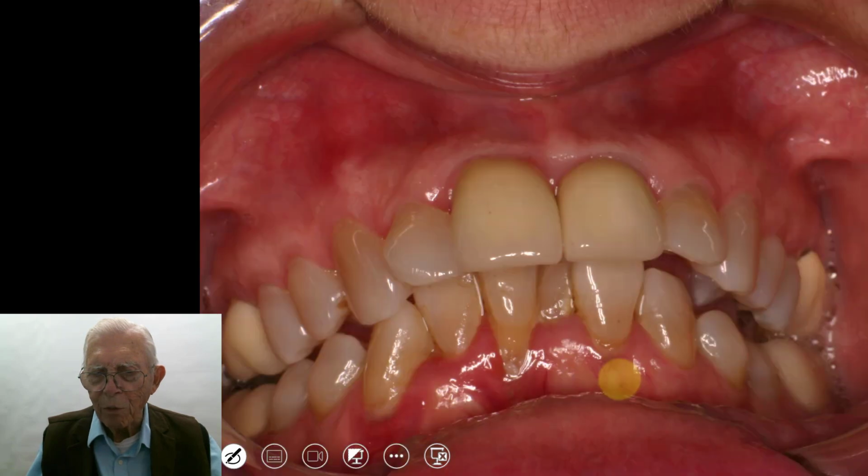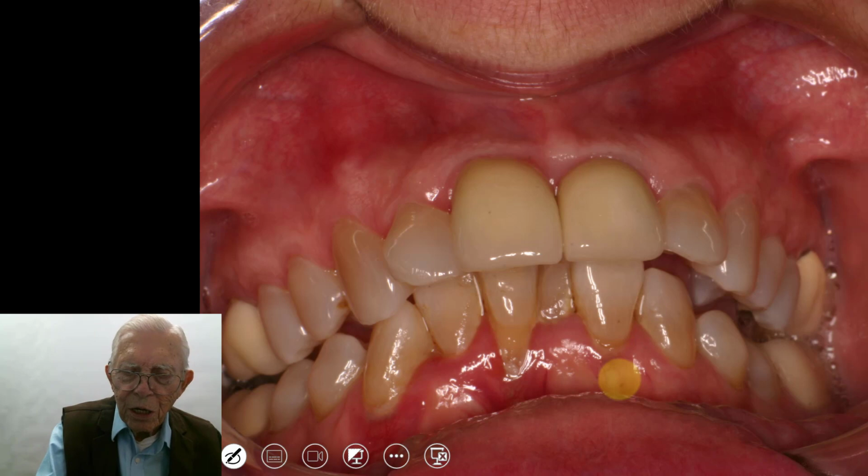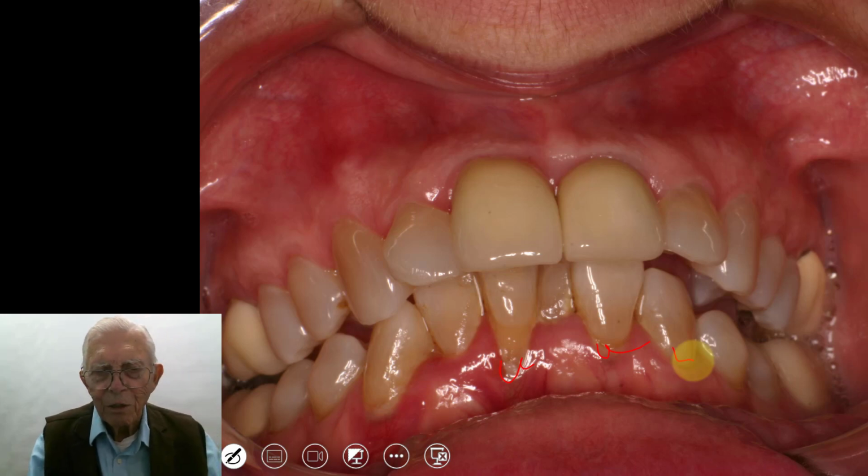So looking at it from the front, you don't notice this pulling back, and then she smiles, you see that lip pull way back in against those lower anterior teeth. And so we want to change that, and we want to fix it. And these teeth, a little problem in here, got to kind of keep that scaled out, have the assistants scale these every time they come in and keep them cleaned out.